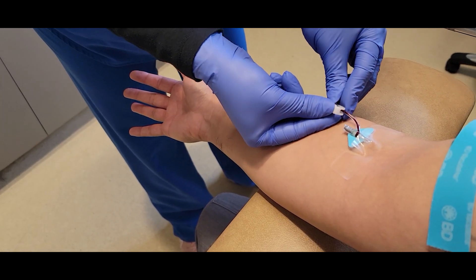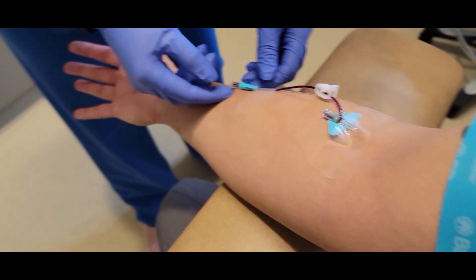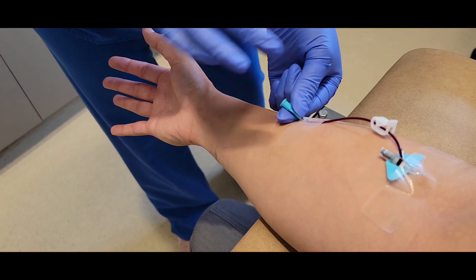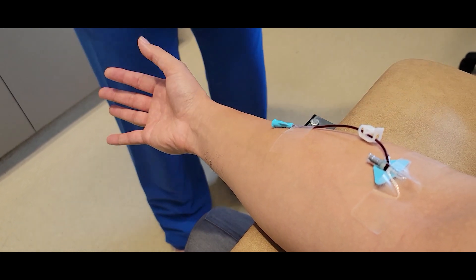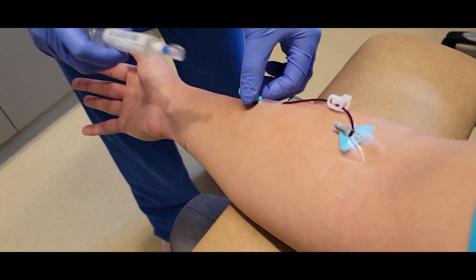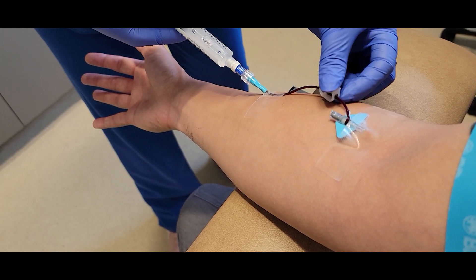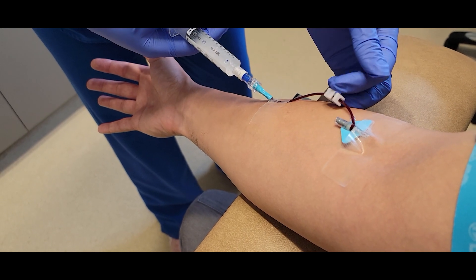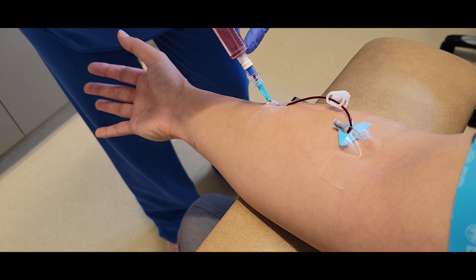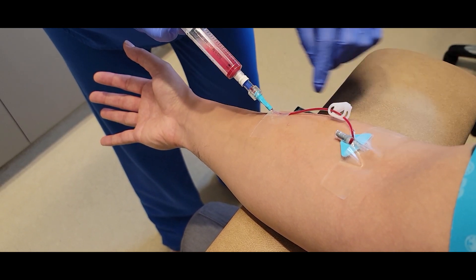Here I'm going to lock the tubing so that the blood does not flow, because I'm going to remove this little stopper at the bottom. If I remove the stopper and don't lock that tubing, then he's going to bleed right out of that opening. And here I have my saline flush. And now that I've attached it with that adapter, I'm going to unlock the tubing and I'm going to pull back and there you see the return of the blood — and make sure the air bubbles rise to the top.